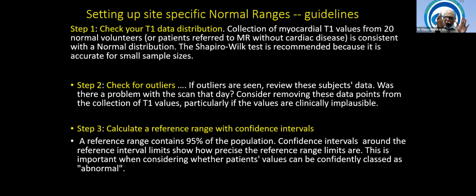So it's 20 we have done. And then identify, in the 20 we have identified. And take one external reference range. What is an external reference range? For example, I've got a 1.5 GE or a 3 Tesla Philips. So for 1.5 GE: same magnet, same FOV, same parameters, same flip angle, same MOLLI sequence.